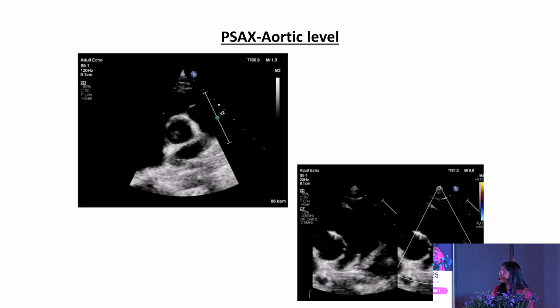It shows again the NCC prolapsing. As we already saw in the parasternal view, the structure which is moving in the left atrium, we can even make out that the structure is attached to the interatrial septum as well. As he had undergone PDA ligation, we kept color sector across the pulmonary branches. There is no residual shunting across the PA branches.